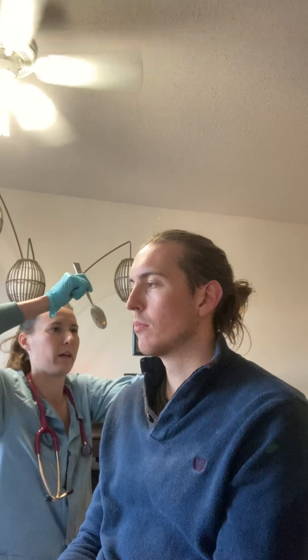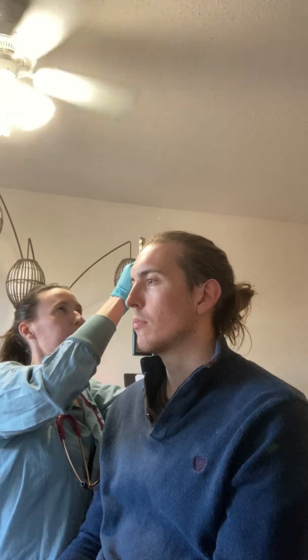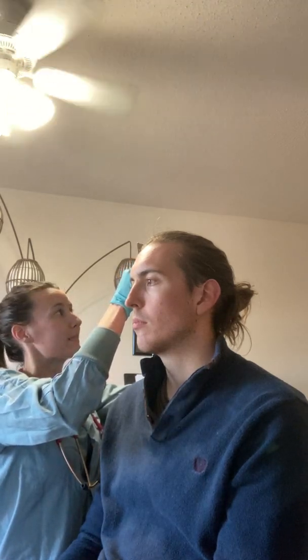I'm looking for your tympanic membrane, and your tympanic membrane, your eardrum, is gray and pearly in color. There's no bumps, lesions. It has good integrity. There's no scarring on it. It looks good.